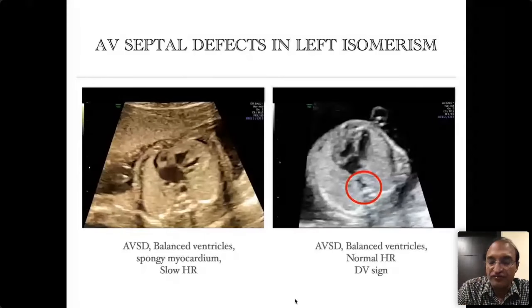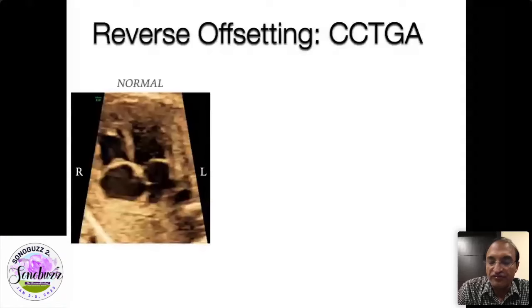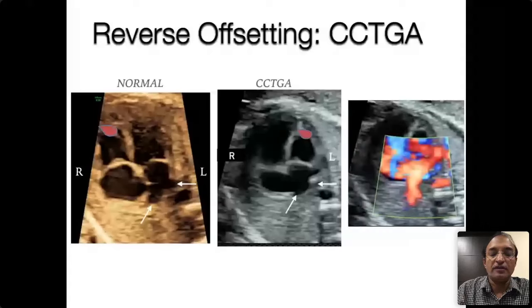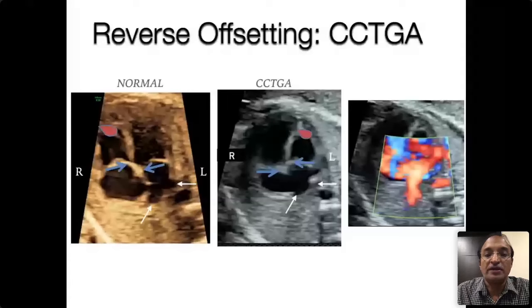Now this is reverse offsetting. Normally the tricuspid valve is at the lower level; in reverse offsetting everything looks the same but the left-sided valve has the lower insertion, as shown here. However, this left-sided valve is actually the tricuspid valve, because the moderator band — shown by the red circle — is on the left side, confirming the left-sided ventricle is morphologically a right ventricle. This is CC-TGA.